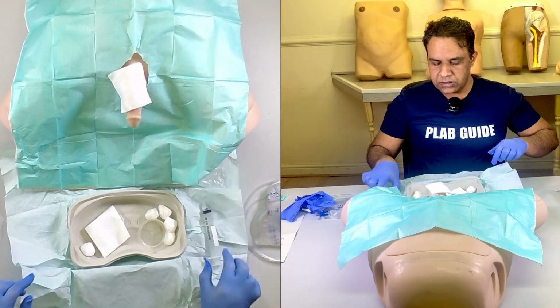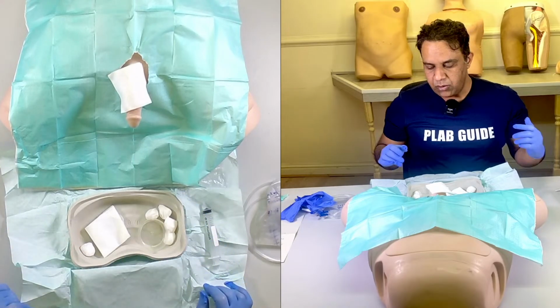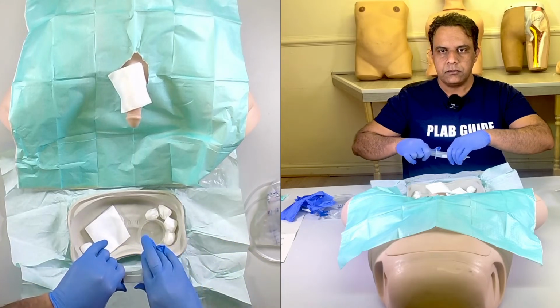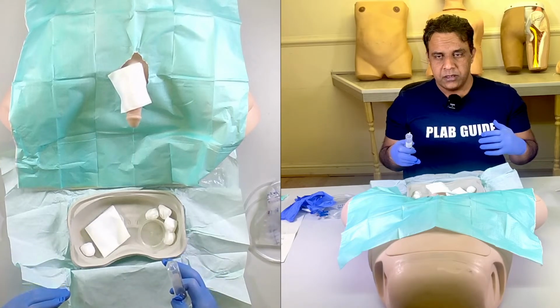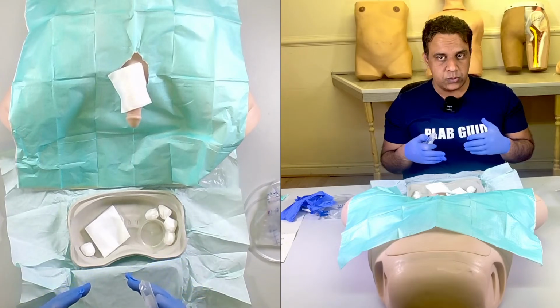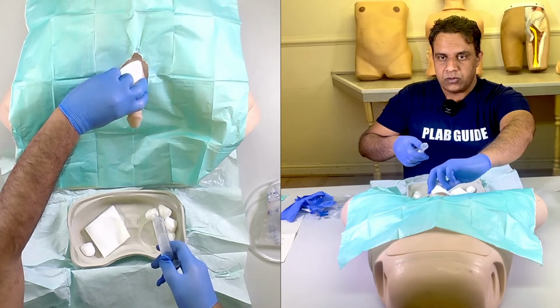We have the instillagel now. The penis is now cleaned. The next thing that you need to do is insert the instillagel. Warn the patient at this point that the patient may feel a bit of discomfort. However, the use of this is to lubricate as well as numb so that the patient does not feel the pain.